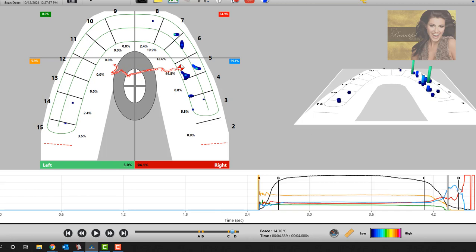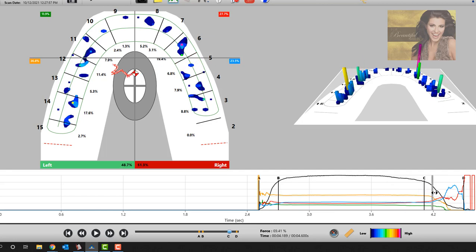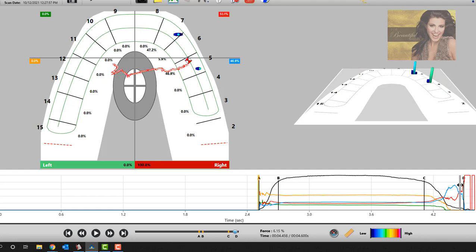Now things just got a little bit longer in your disclusion time, right? Because 6 and forward is anterior, and then 5 posterior, wherever those tooth contacts are, belong in this posterior quadrant. And so now the data you're getting matches what's actually going on in the mouth.